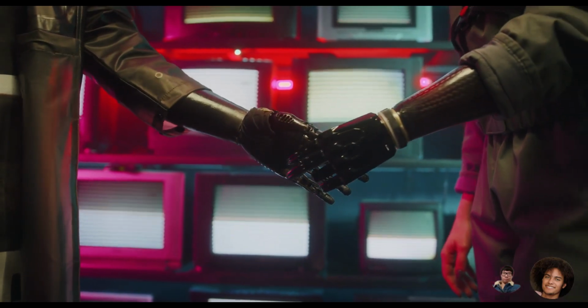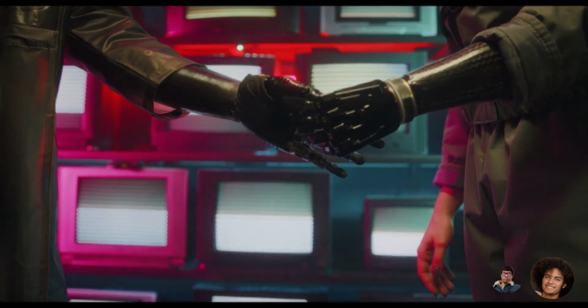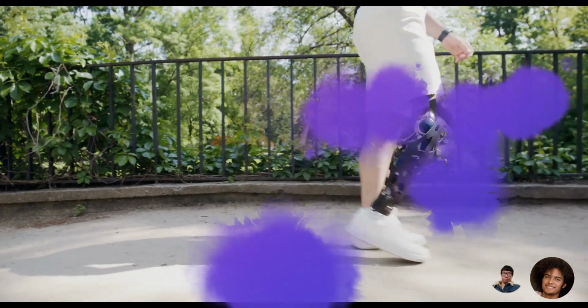This is where non-invasive brain-computer interfaces, or BCI, which is the focus of our capstone project, comes in. Non-invasive BCIs can use techniques such as EEG to measure the neural activities and decode it into control commands for a prosthetic limb. It enables direct communication to provide a more natural and intuitive control for the user.